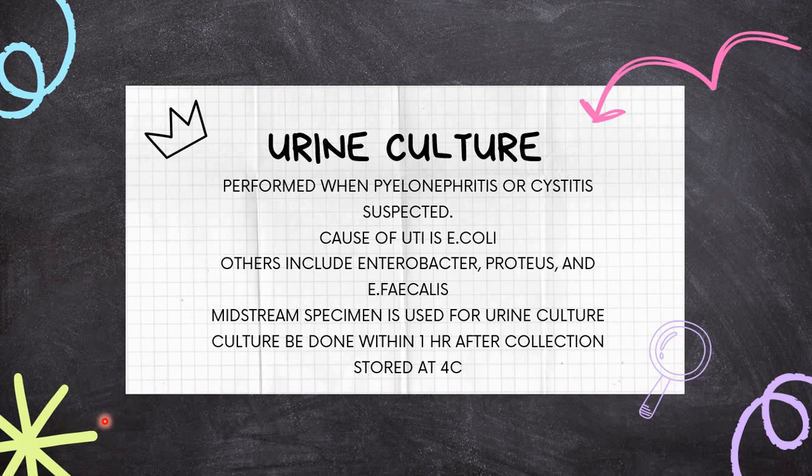It is commonly accepted that a bacterial count of at least 10^5 per ml must be found to conclude that significant bacteriuria is present in asymptomatic persons. There is evidence that as few as 100 per ml are significant in symptomatic patients. For this determination to be made, quantitative or semi-quantitative cultures must be performed.